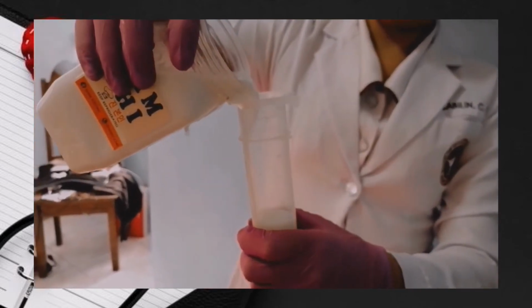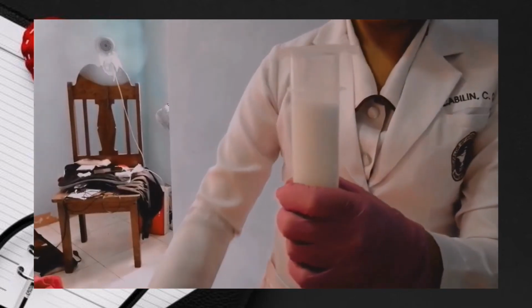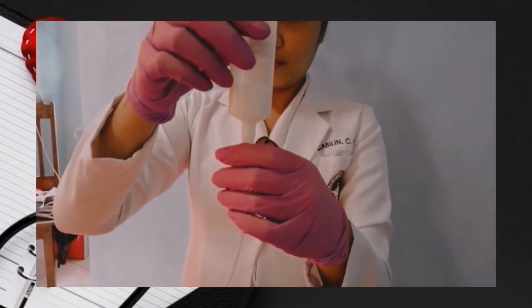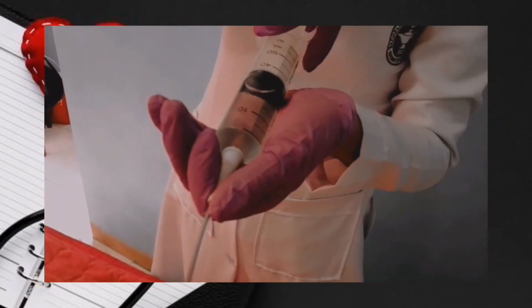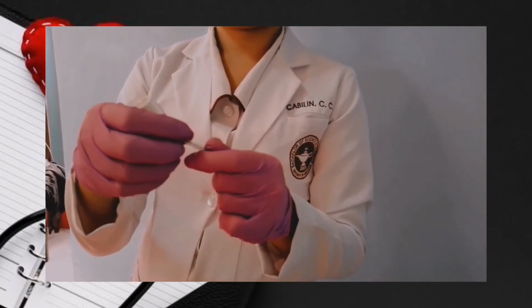The next procedure is to pour the prescribed amount of feeding into the syringe. Open the clamp and allow it to empty, adding more feeding as the syringe empties. Follow the feeding with 50 ml of warm water. This is to provide nutrients as prescribed. The next procedure is to clamp the tube before it empties and remove the syringe. This is to prevent air from entering tube.